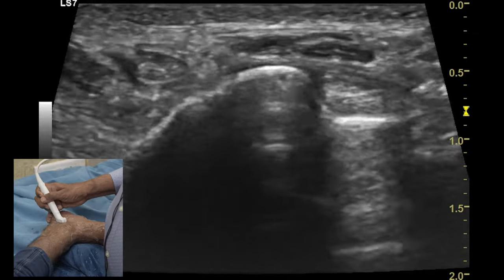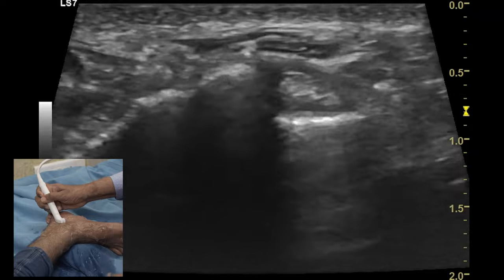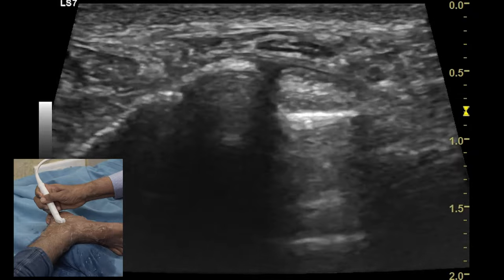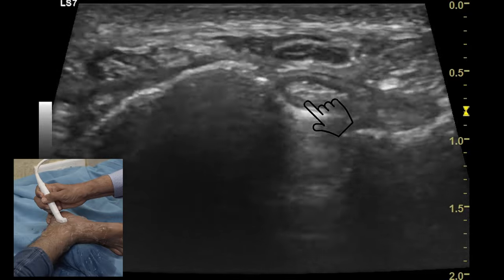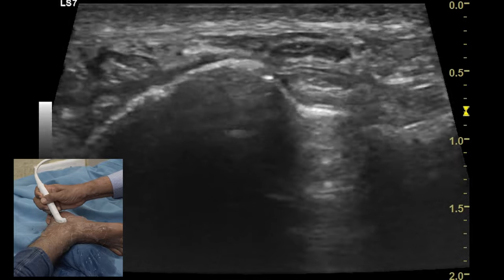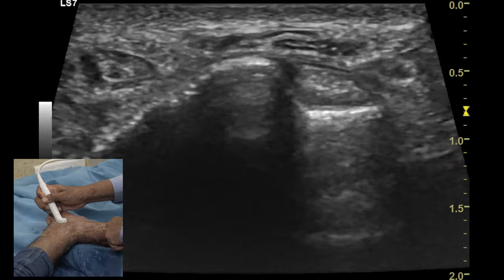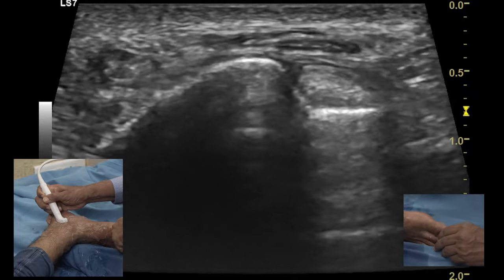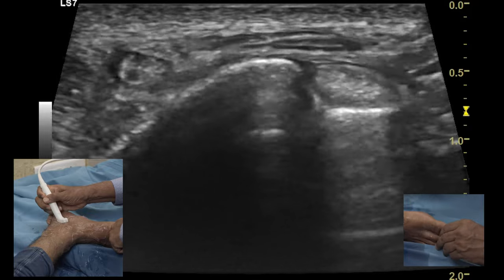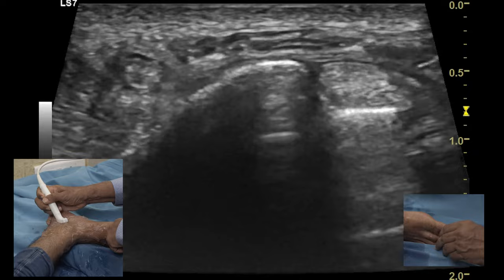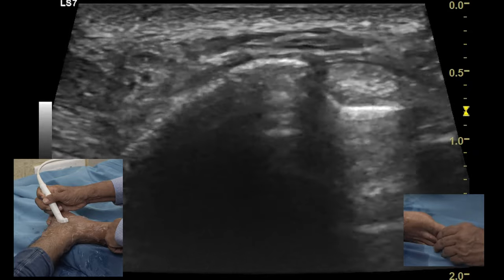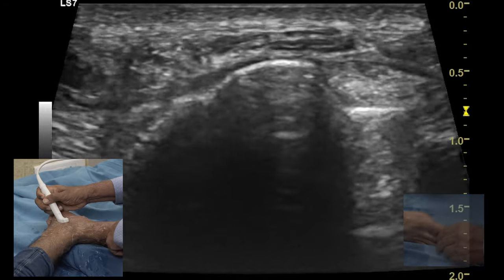By moving the transducer more posteriorly, the third tendon of the flexor group is identified — the flexor hallucis longus — situated in the groove between the medial and lateral talar tubercles. If you want to confirm the presence of this tendon, you can do passive extension and flexion of the great toe and this tendon can be seen moving backward and forward, demonstrating its integrity.